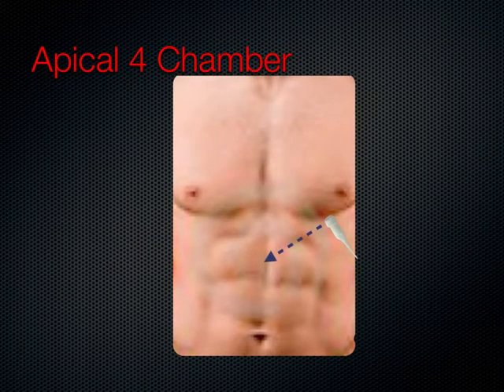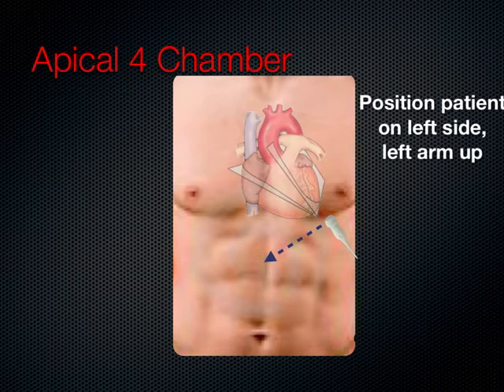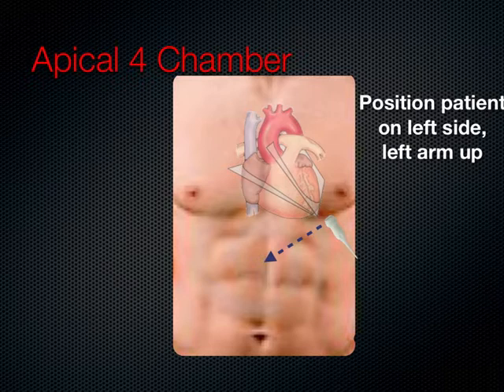After looking at the subcostal view and the inferior vena cava, we move to the apex of the heart and get a four-chamber view looking up from the apex into the thorax, with the indicator towards the patient's right. The probe is placed approximately where the patient's apex is, which can vary significantly from patient to patient — some are more lateral, some more vertical depending on comorbidities. If you can't get a good view, roll the patient onto their left side with their left arm up to open the rib spaces and allow the probe to go between the ribs.